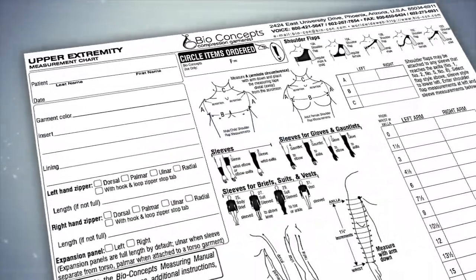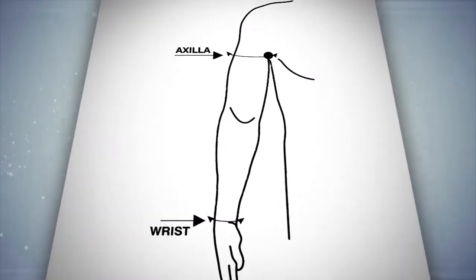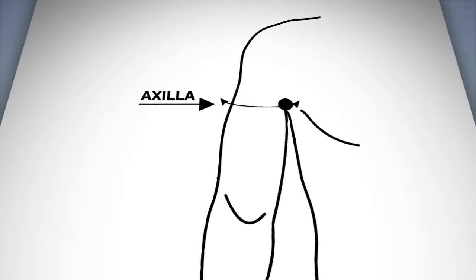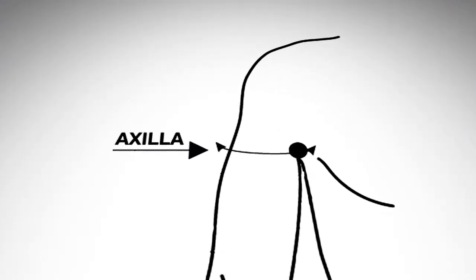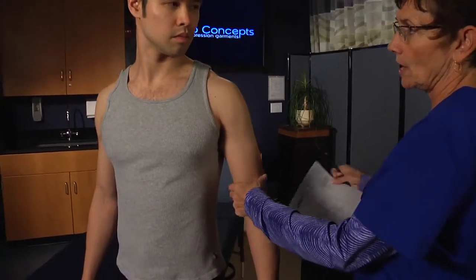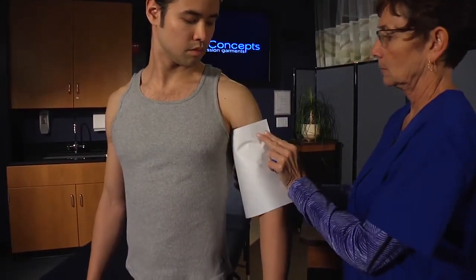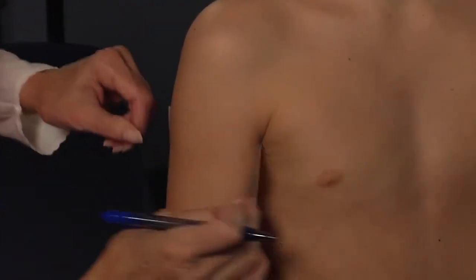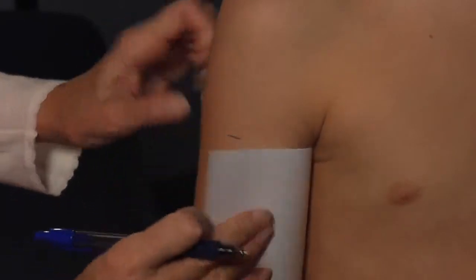It is critical to know the measurements you need before you start measuring. Inadvertently measuring too far up the arm above the axilla is a common problem that results in sleeves that are too long. Here is an easy procedure to make sure you do start at the axilla: have the patient hold the arm out a bit, then tuck a sheet of paper into the axilla. Wrap the paper around the arm and make a mark at the top of the paper on the lateral arm. Measure from the wrist and up, but don't go past this mark, or measure from the mark down.